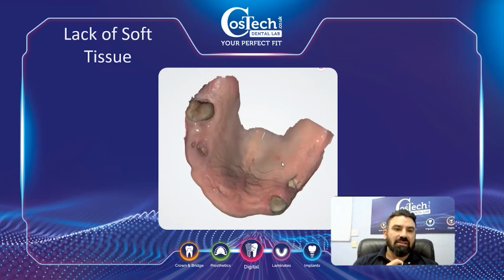If that's the case, we might not have an option but to go down the traditional workflow and special tray. But these are edge cases. As you do more and more cases, you will work out ways to use your scanner optimally.